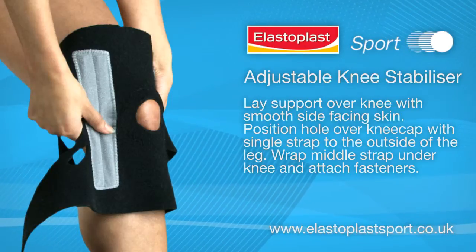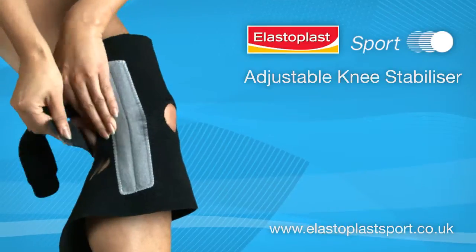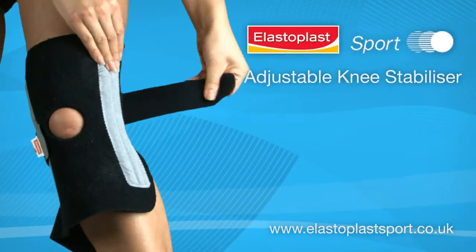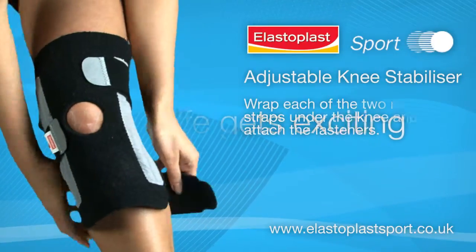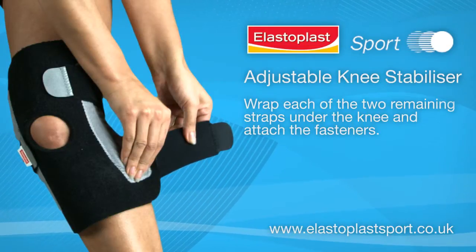Wrap the middle strap under the knee and attach the fasteners. Then wrap each of the two remaining straps under the knee and attach the fasteners.